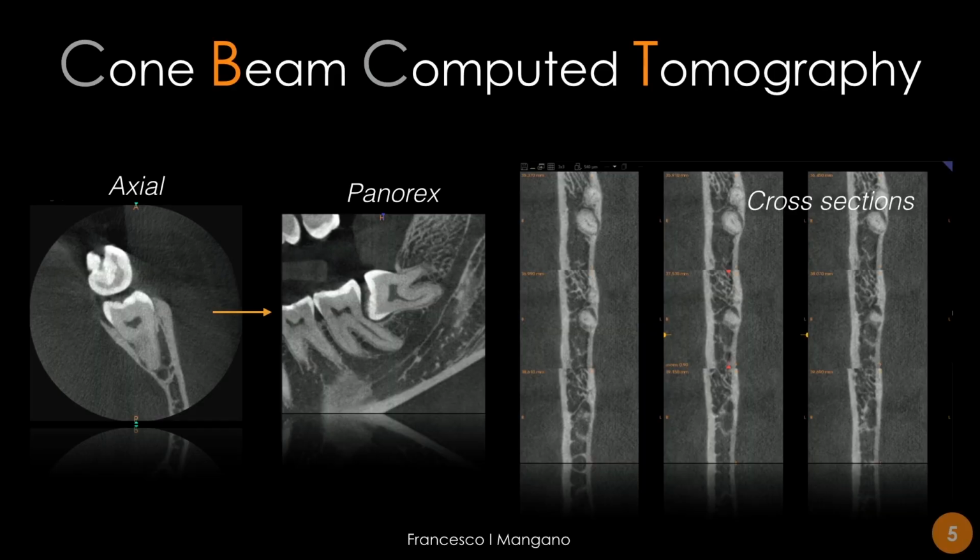We can really benefit from the machine. And in the previous lecture, I showed you how the possibility of using the different multiplanar reconstruction of CBCT allows us to visualize anatomical structures in 3D. So the risk, for example, of this extraction, because the roots are very close to the inferior alveolar nerve.